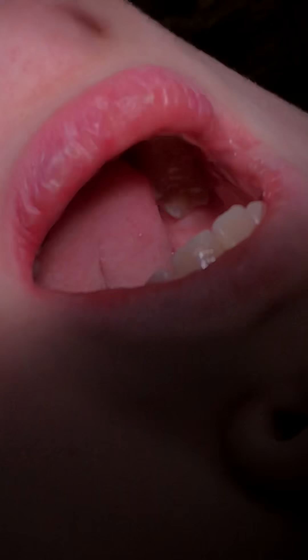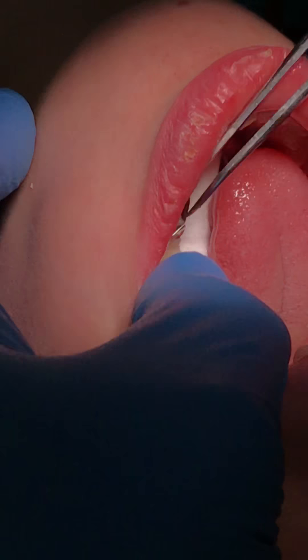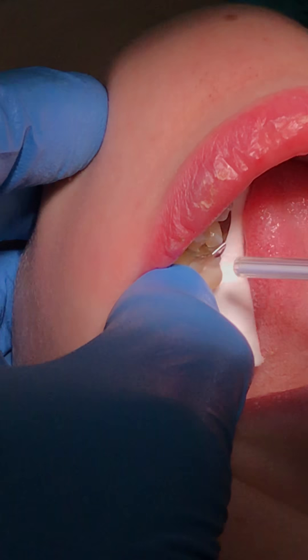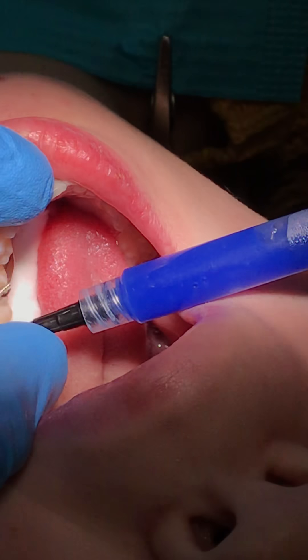The other thing we need to do is make sure we control moisture. That's looking good. Then the next thing we want to do is do our etch — primarily you get most of the bond from the enamel.